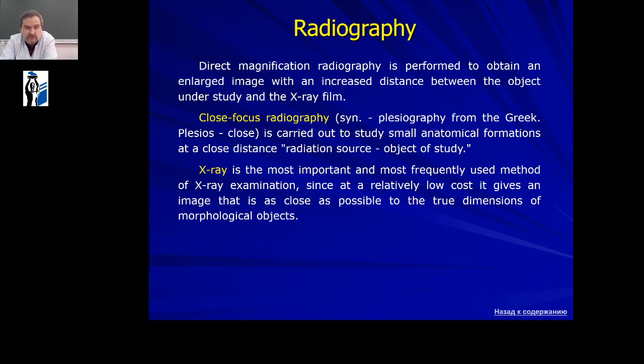Close focus radiography, or plesiography, from Greek plesios, close, is carried out to study small anatomical formations at a close distance from radiation source to object of study.